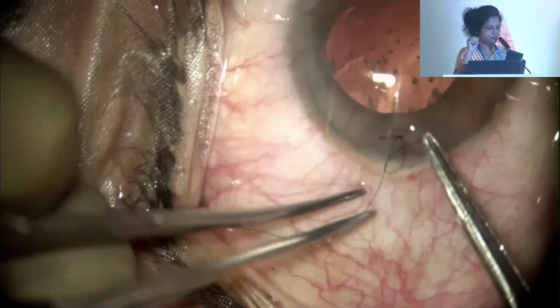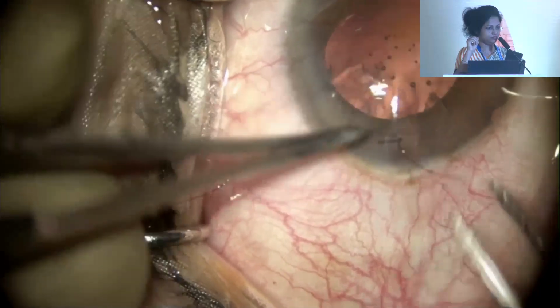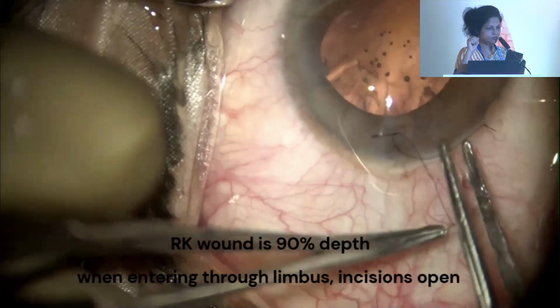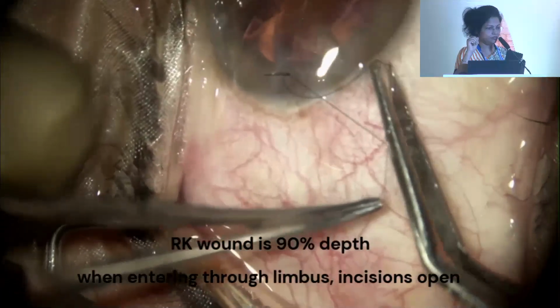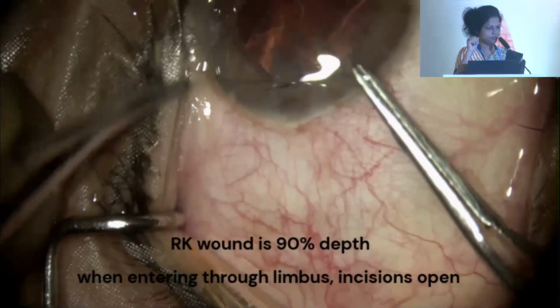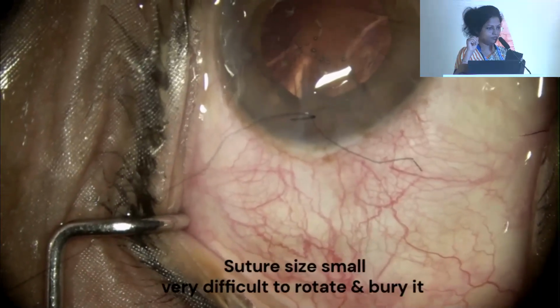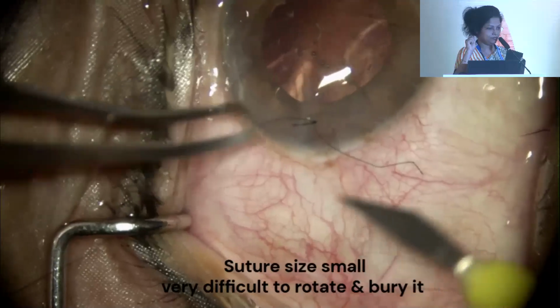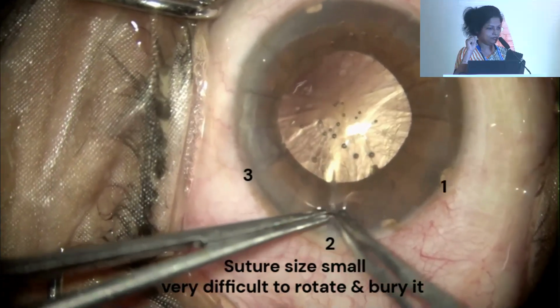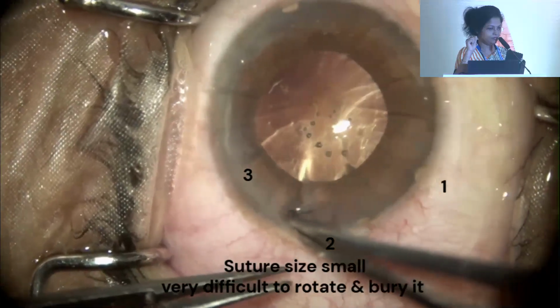At the end of this phaco surgery, you can see we are suturing the wounds because the RK wound is already 90% depth, so whenever we enter near the limbus, it will open up the incisions. We are trying to suture; however, you might notice the suture is so small that it is very difficult to rotate the suture and bury it.